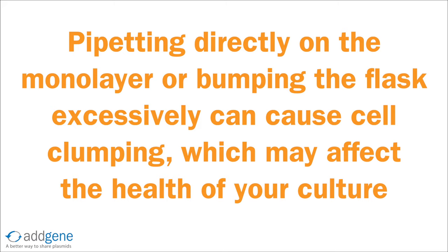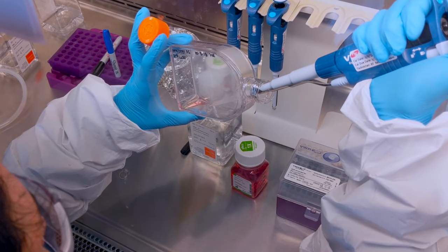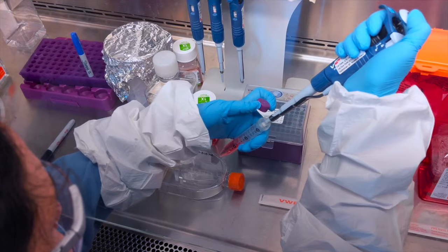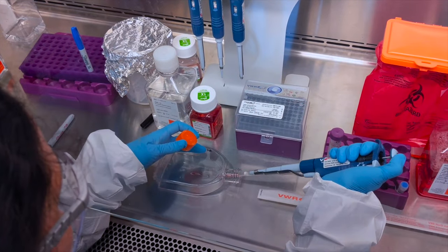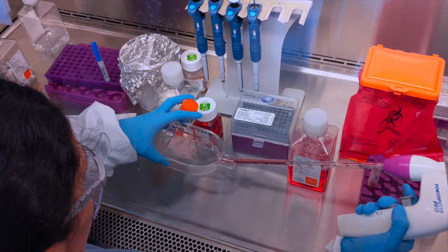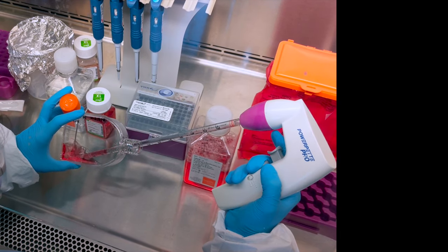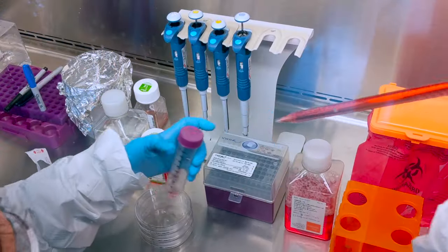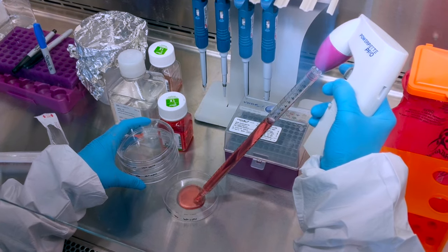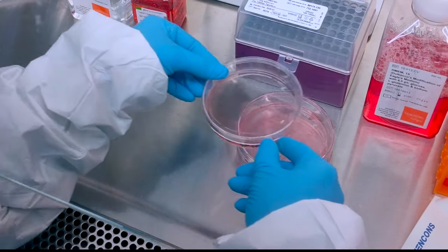Cell clumps can be very difficult to break up and will affect the health of the culture. Instead, hold the flask at an angle and pipette onto the top surface of the flask. Gently rotate your flask back and forth to evenly disperse the liquid. When you begin to seed a new culture vessel, be sure to evenly distribute the cells throughout the growth surface. Insufficient mixing will lead to patches of cells that are over or under dense and negatively affect the overall health of the culture. We recommend using a serological pipette to thoroughly mix the cell suspension to ensure even distribution. When seeding multiple dishes or wells, consider preparing a master mix containing all of the cells and media for all of the dishes rather than seeding each vessel individually, as this tends to result in better uniformity across plates and therefore more reliable data.